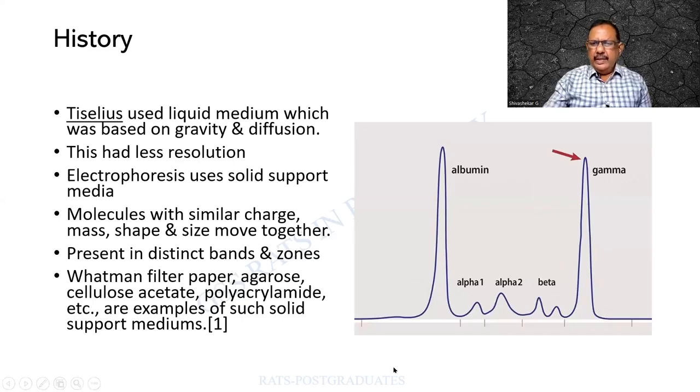And this incidentally is a graph which we always tend to identify. There is an albumin and a gamma globulin. So these get separated in a process of electrophoresis. Gamma or the M protein, you people know in what condition it is increased.